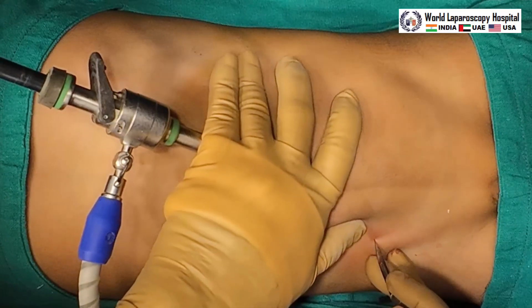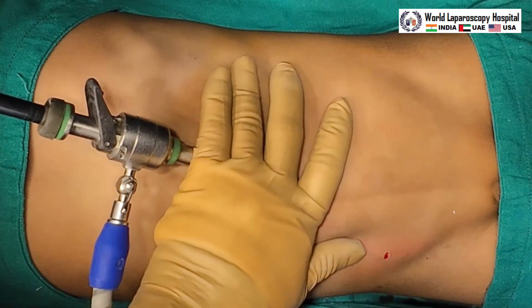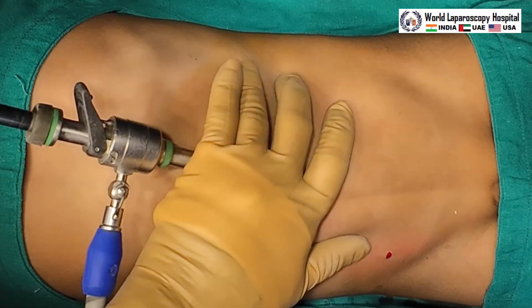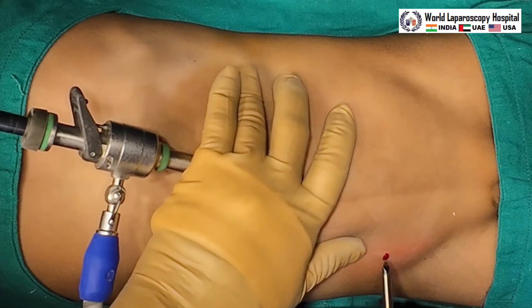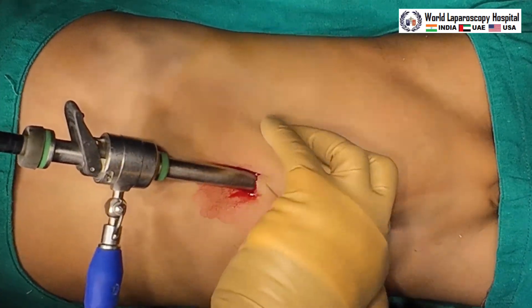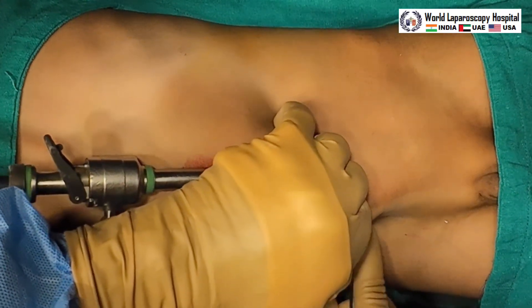This patient has a left-side inguinal hernia that is congenital. Basically, in pediatric patients you will only get indirect inguinal hernia. The second port will be for the right-hand instrument.